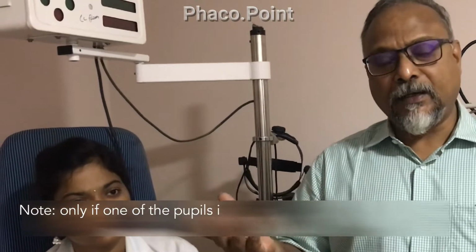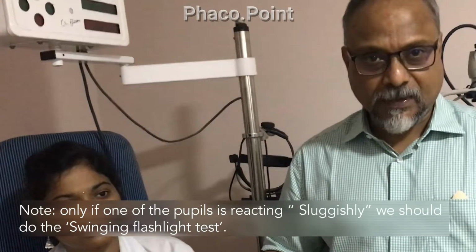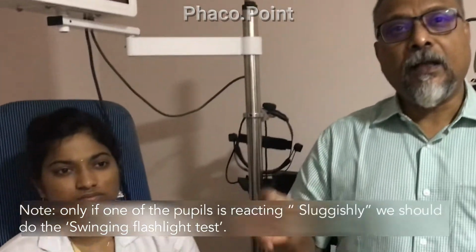Now the problem will come if one of the pupils is reacting sluggishly. So if one of the pupils is reacting sluggishly, then we have to use a complex interpretation of the direct and the consensual light reflex in order to find out whether the block is an afferent block involving the optic nerve or the pathway, or it is an efferent block involving the third nerve or the oculomotor nerve.